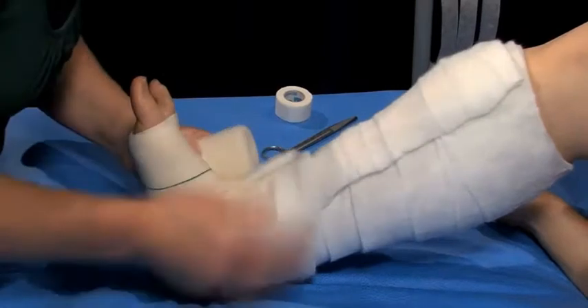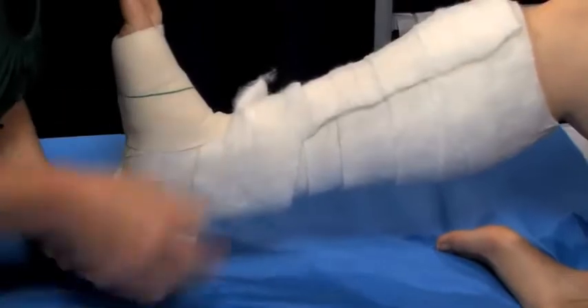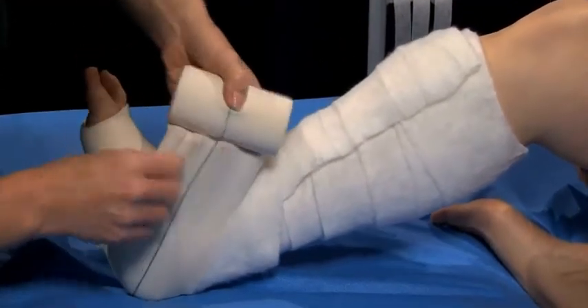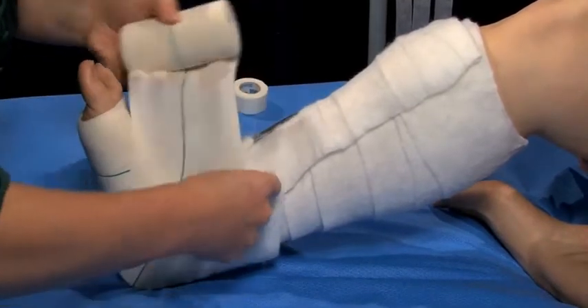Begin the bandaging at the base of the toes. This will prevent a build-up of interstitial fluid or oedema occurring in the toes and forefoot. Perform an ankle or foot lock, fully enclosing the foot with enough tension to prevent displacement.